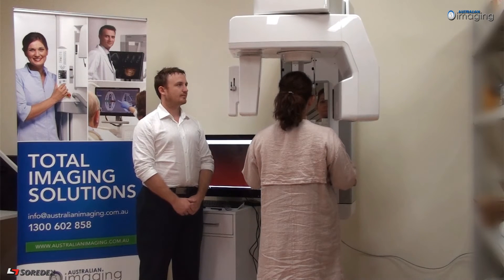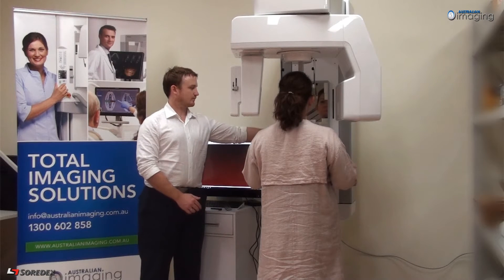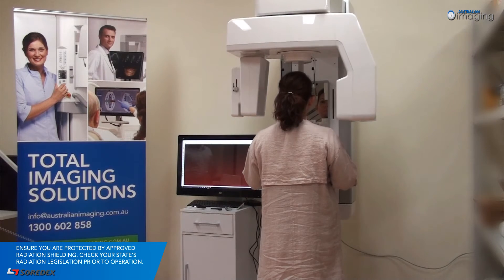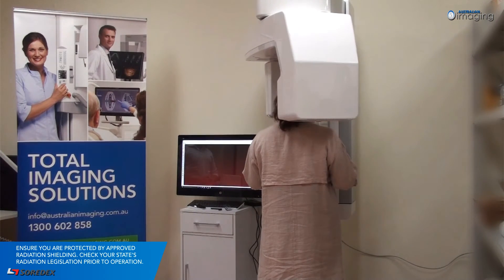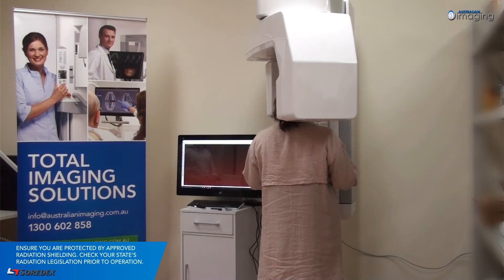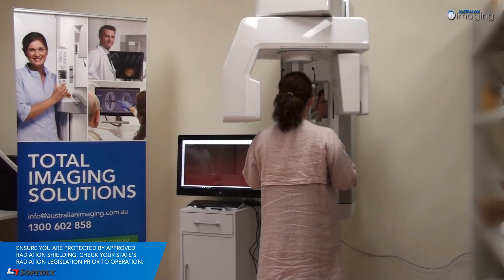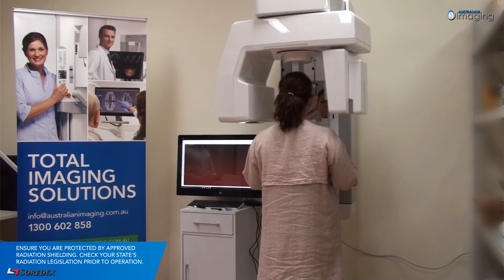Begin by pressing the return button. On the control panel, select the scout modality, protect yourself from radiation, and then press and hold down on the exposure button. The scout image will appear in the control panel where you can make any necessary positioning adjustments. Height adjustments require manual correction of the chin rest, whilst all other adjustments can be performed using the arrow keys on the unit screen. Retake the scout if major adjustments were made.